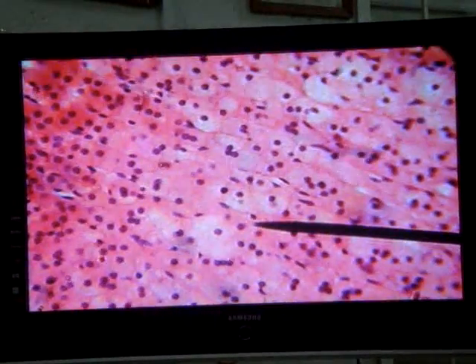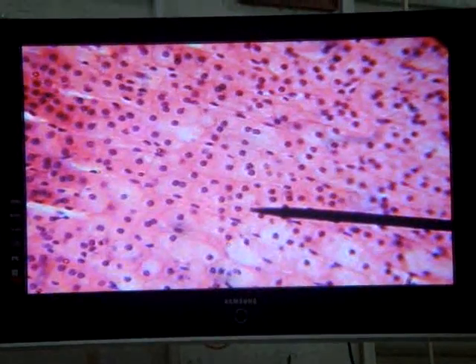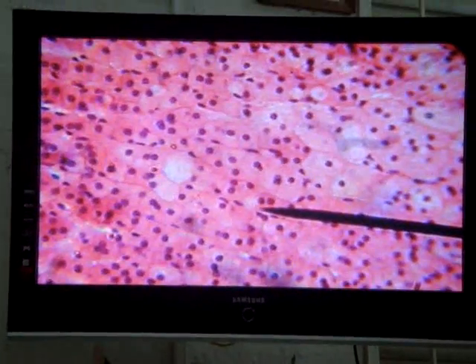Pale. The other thing you may want to ask yourself is, why am I seeing some cells in the fasciculata that are paler than others? For example, this one I'm pointing at is very pale, and this one is pale, yes, but not as pale. This difference in the intensity of staining is due to the fact that the concentration of the hormone in the 2 cells is different. Also, this layer of cells is intimately associated with numerous fenestrated capillaries as well.